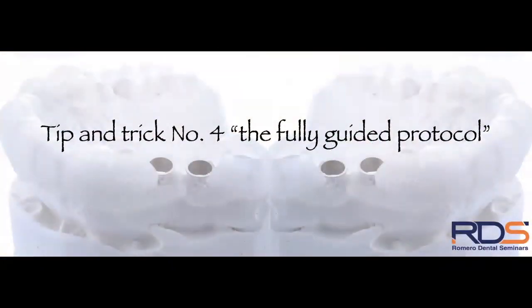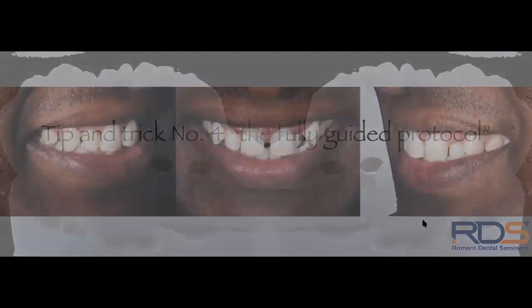And my final tip and trick for the day is going to be the fully guided protocol. I'm going to share a couple of things here that I think are going to be very valuable for you, because they're not only going to allow you to use an external lab. For this particular case, we used Oral Arts Dental Laboratories to fabricate our guide. But I'm going to share with you how you can fabricate this guide in your own office at an affordable price, with an affordable investment.